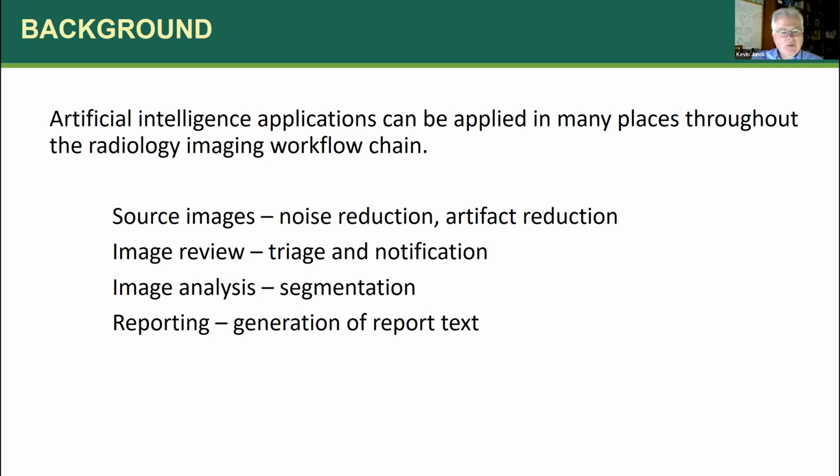Image review. Now, this is the thing that, like I said, gets kind of a lot more of the buzz. Basically, images go to a system, it looks for something, it might notify you, hey, I think that there's this particular finding on this type of image. And maybe you want to triage it, bump it up in your work list and look at it next amongst those 10 CT exams that you've got to read. Hey, let's flag this one so that it becomes the hot one to look at next.